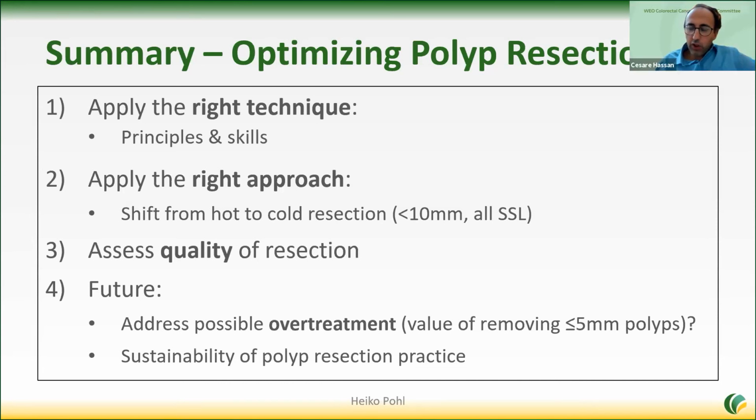Heiko, you created this methodology of segmental metachronous neoplasia to understand the incompleteness of resection of the endoscopist. We are with WEO, and there are a lot of people who are responsible for organized screening programs where you can have this data of metachronous recurrence. Should we apply your methodology to our organized programs to understand the rate of incomplete resection in our programs?